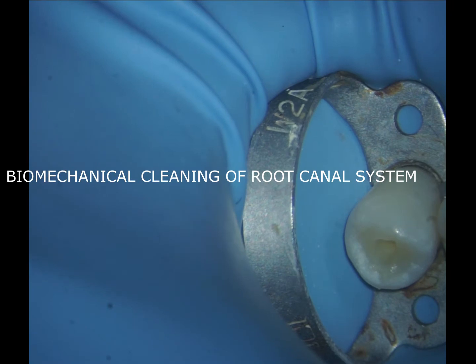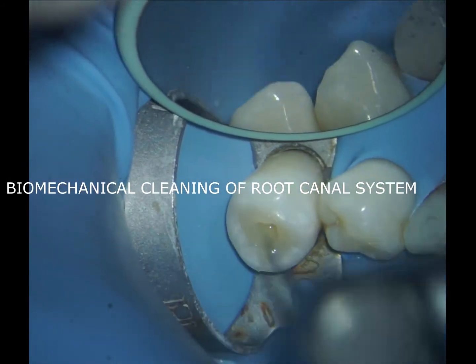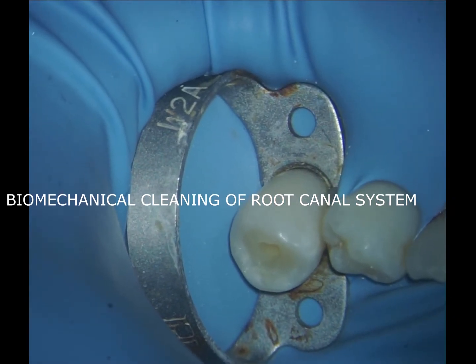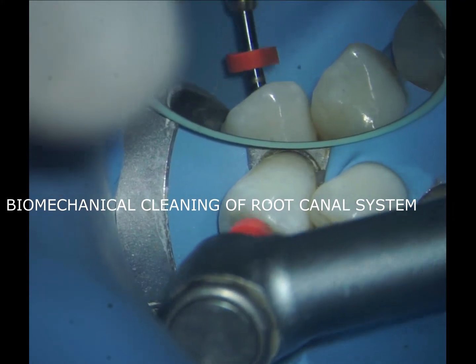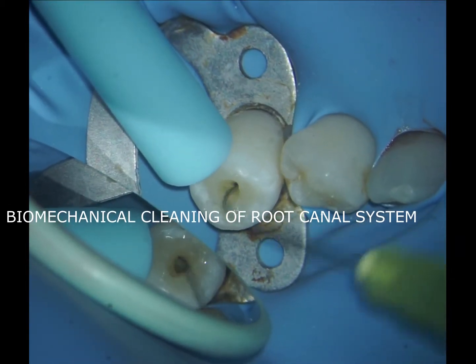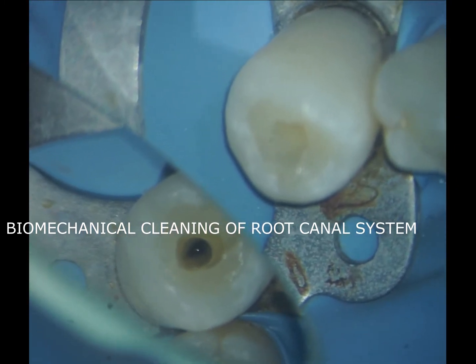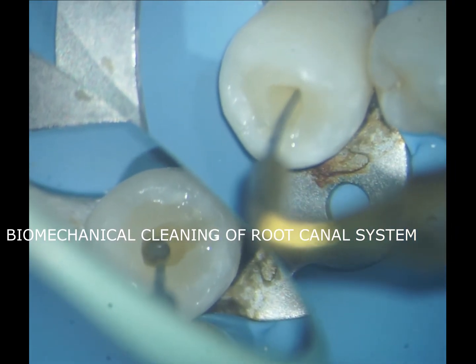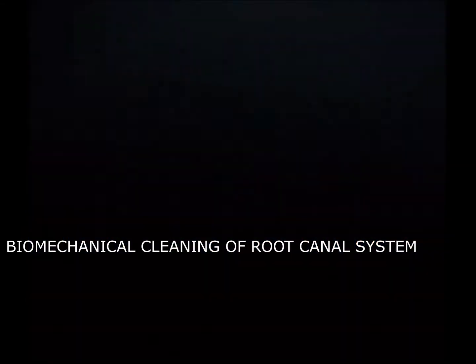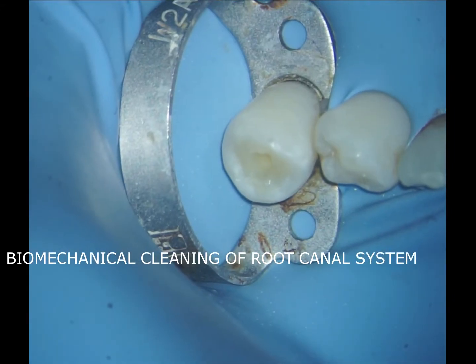The first file — the 15/05 — is very easily going to the apex; we moved it in two or three strokes and reached the working length. The next file is 25 tip with 4% taper. After each file, we irrigate the canal copiously with sodium hypochlorite. Since we're using the rubber dam, we're able to use full-strength sodium hypochlorite, which in my opinion is the solution that makes the major difference to your root canal goals. I spend more time with irrigating solutions rather than just biomechanical debridement with files.